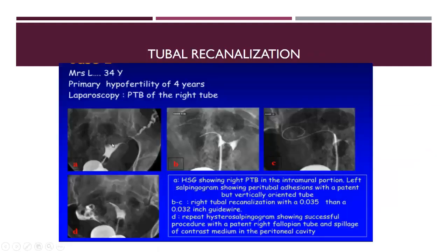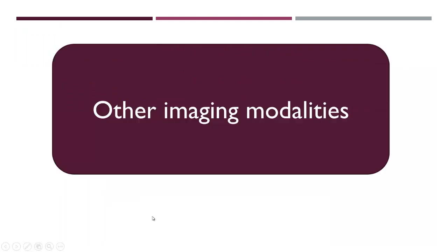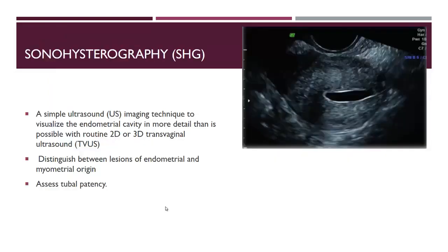This is tubal recanalization. Here, guide wire, and after injection we found that the tube became recanalized. What are the imaging modalities for assessment of the fallopian tubes? All of them are of lower importance compared to hysterosalpingography.